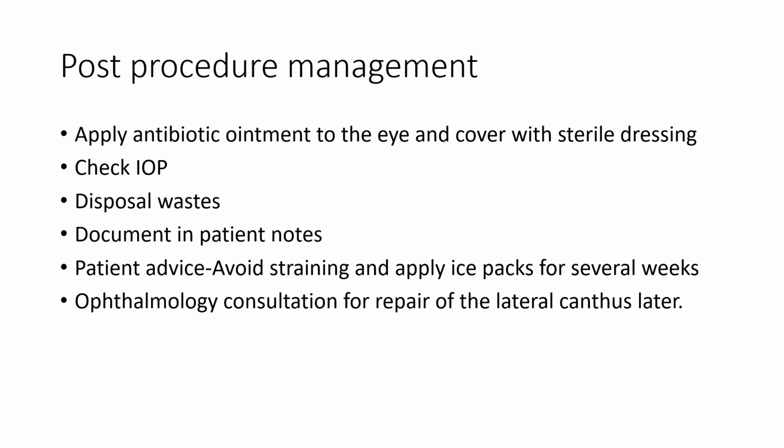Then the procedure itself: identify the landmark, apply the local anesthetic, do the incision, then cut the lateral inferior canthal ligament, then post-procedure management and monitor the patient. So this is about lateral canthotomy.